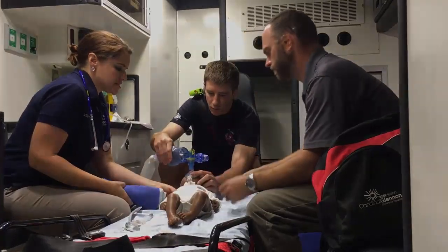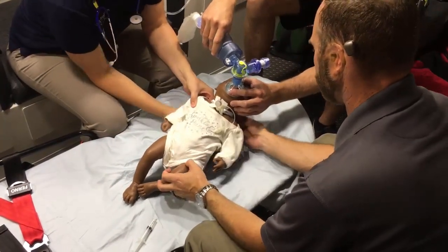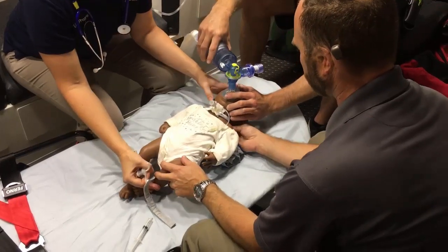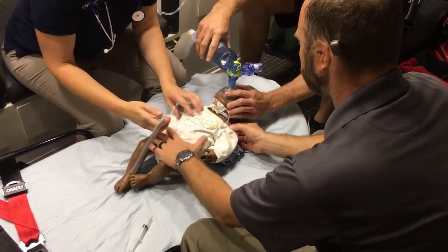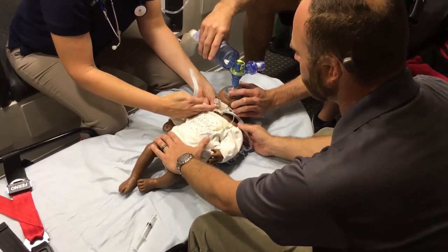Let's get her in the proper position. I'm going to position her with a towel roll underneath. Let's get her hyperextended here so we can really expose that area. Can you go ahead and get her ties undone for me? Her ties are undone. The cuff is deflated.